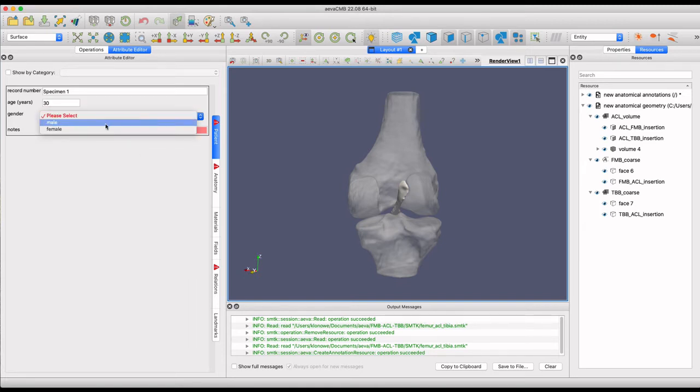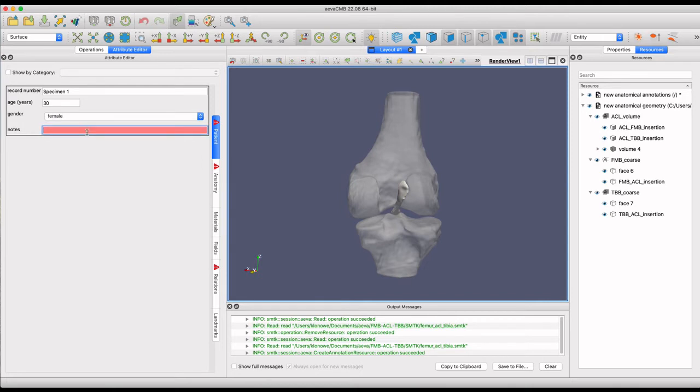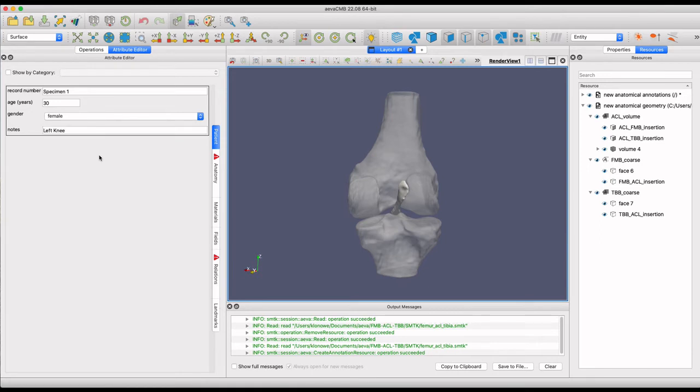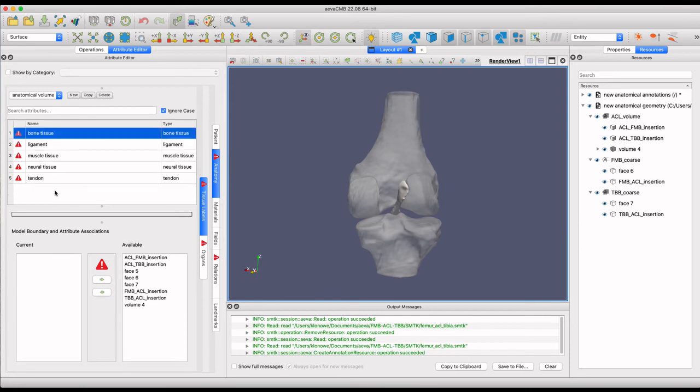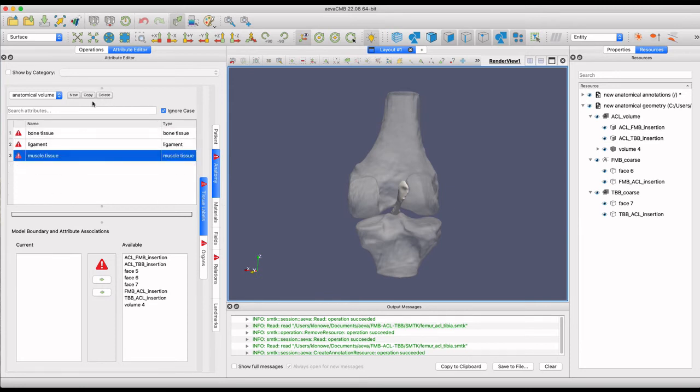In the Attribute Editor, one can choose from a variety of tissues to associate with the geometry from the resource tree. The available attributes can be removed or one can add custom attributes. The available geometry will appear in the section below to be associated with each attribute.